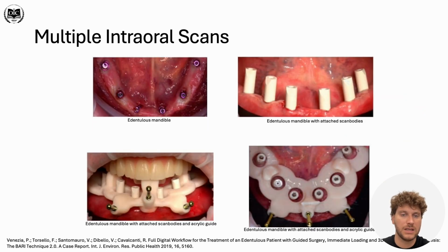As previously mentioned, we have these individually fabricated stents for the patient, which we can utilize not only to improve the implant scanning accuracy, but also to improve the bite scanning accuracy as well. So, two shots in one. This is really convenient, but it also needs another visit to be produced, and additional costs are involved.